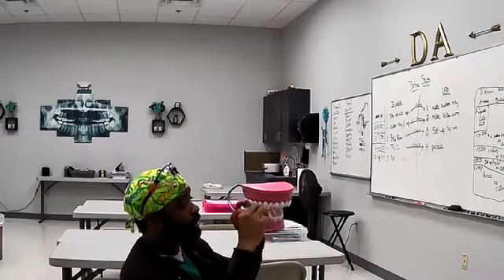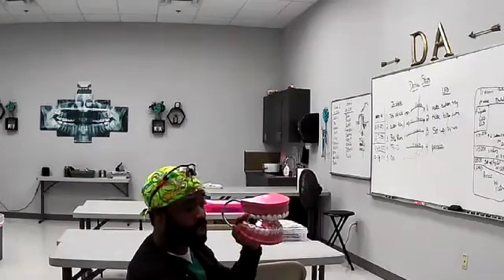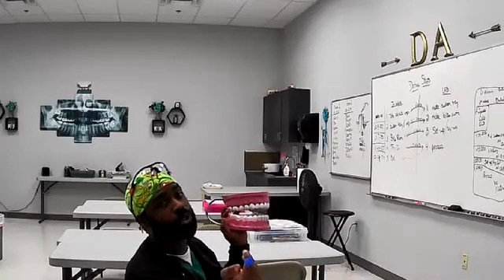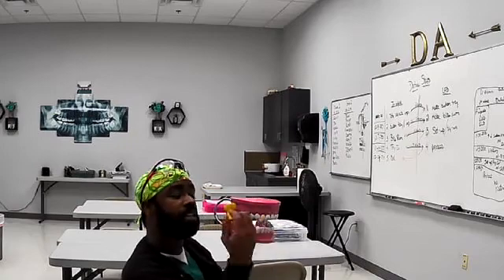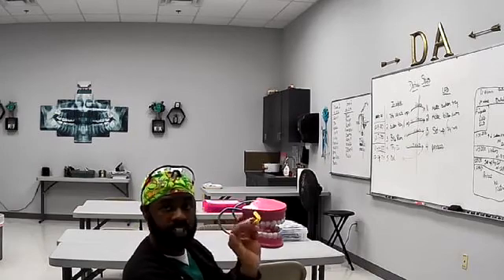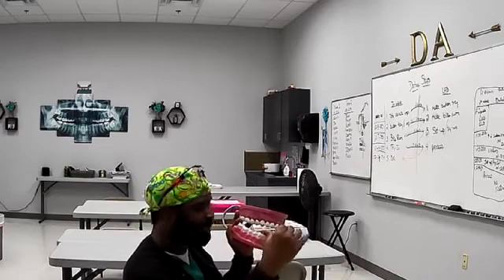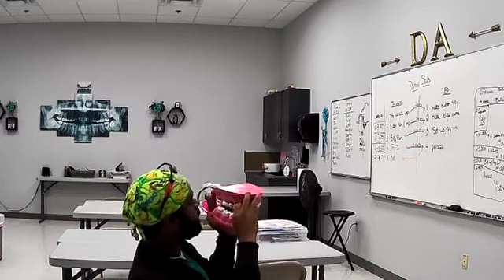You can double up 2 teeth per shot or per sensor, depending on your dentist, so you have to check with them. Most of the time, however many teeth you can get in the film is fine. That way you don't have 32 single films. So just go around taking all the X-rays.